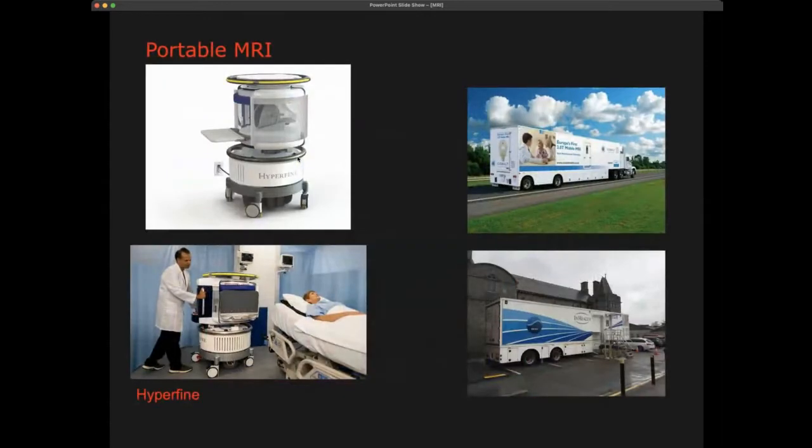And so sometimes they have found solutions for this. There is currently a very portable scanner being developed. This is still under development. That is quite portable, but with, of course, much less resolution and possibilities. But in several countries, you actually get a full-blown, high-resolution scanner which is being put in a truck.